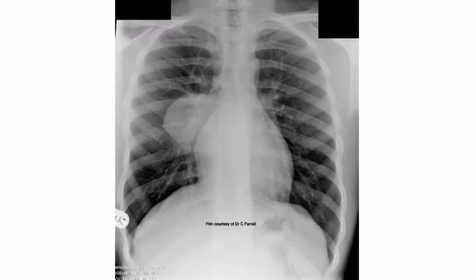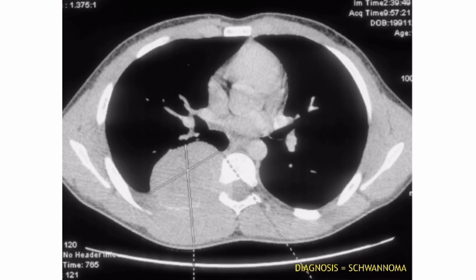Here's another chest X-ray where the hilar vessels are visible through the mass, as well as the right heart border, which means that the mass is in the posterior mediastinum. Again, we can see on the CT that it is a schwannoma.